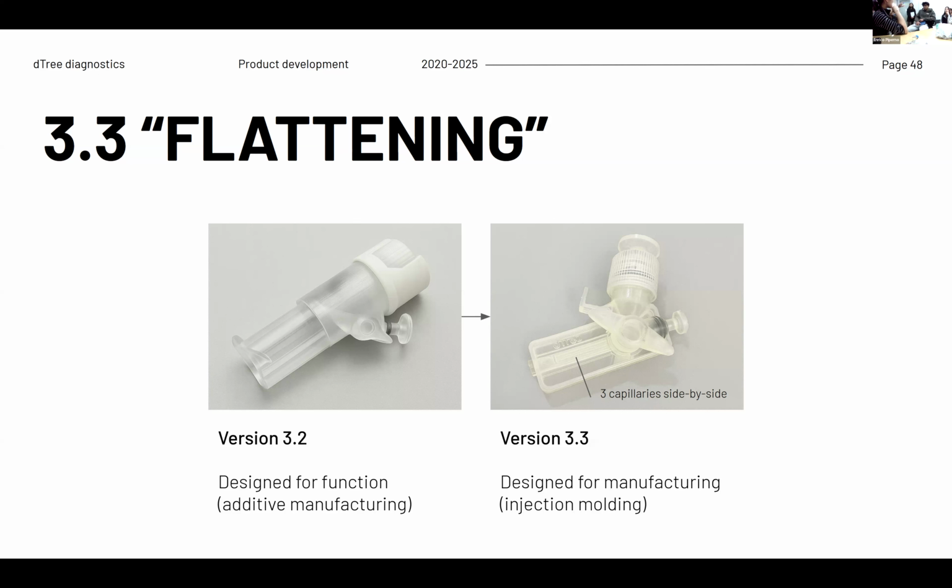The control? No, so remember we have to capture exact volumes, right? So the exact volume is determined by this inner cylinder, the thing that rotates, right? This valve that rotates. This is like resin, so it sticks. Essentially, it rotates, right? Like this. So that captured volume is 50 microliters because I have a double chamber, so 50 microliters.